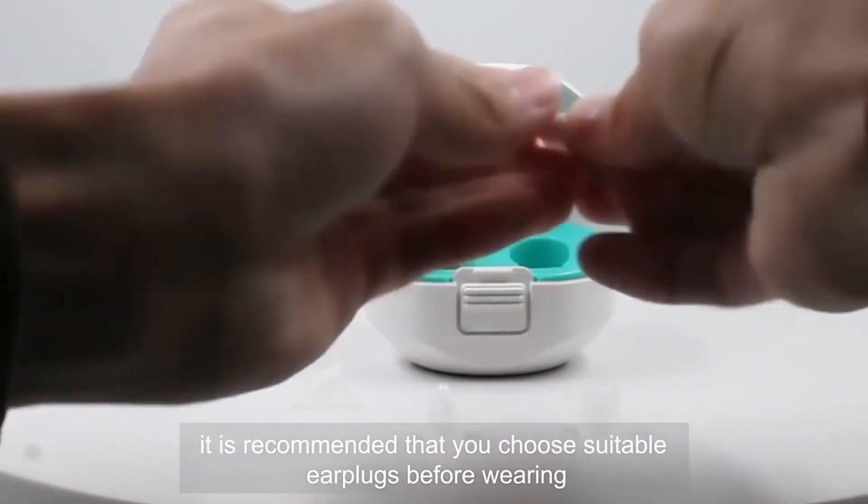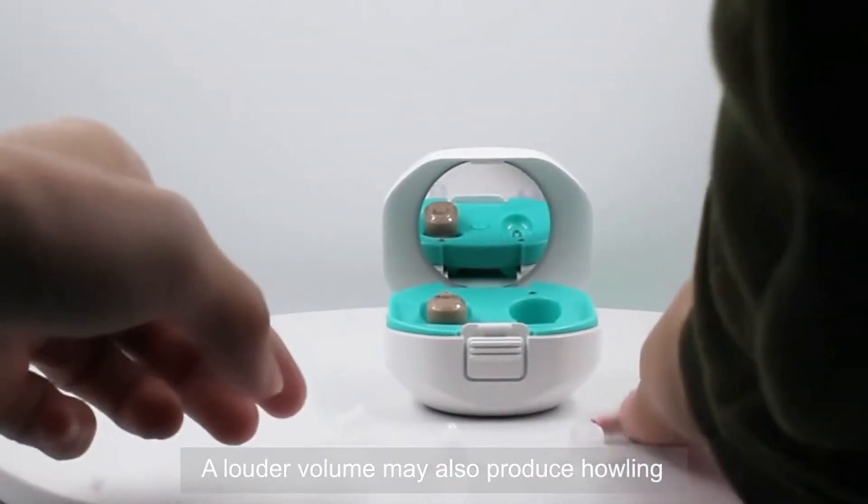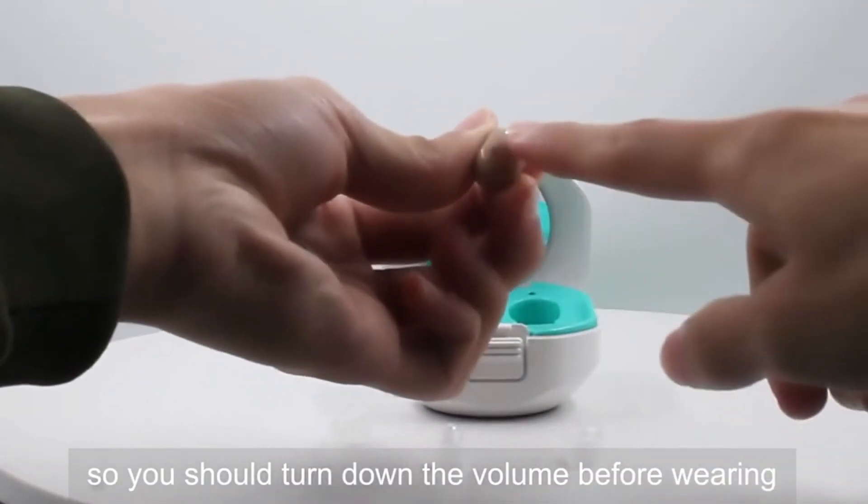If the ear plugs are too large, there will be a foreign body sensation. A louder volume may also produce howling, so you should turn down the volume before wearing.